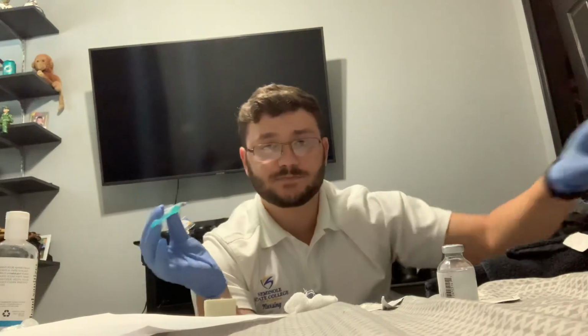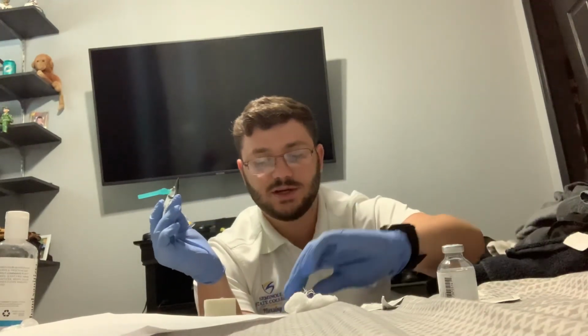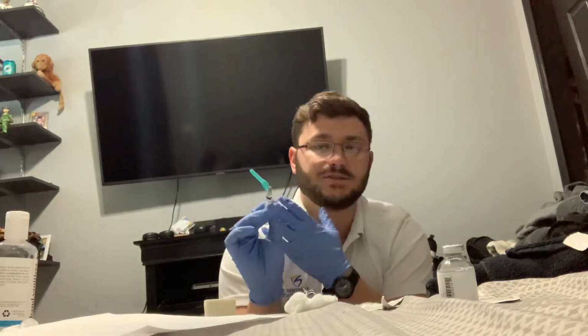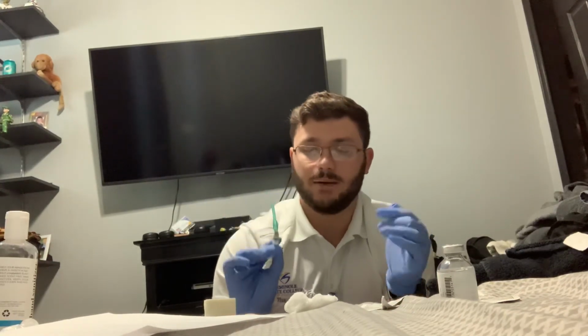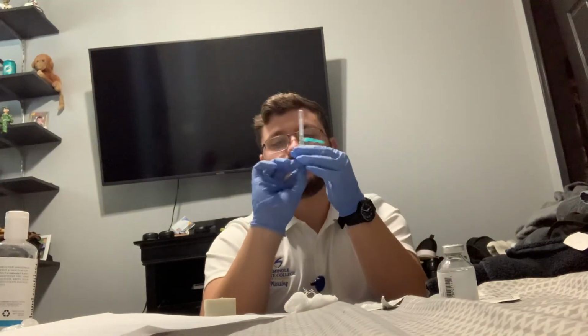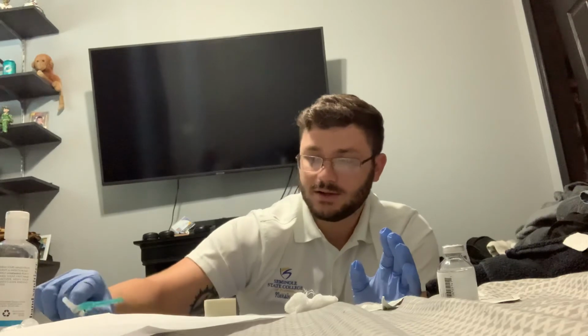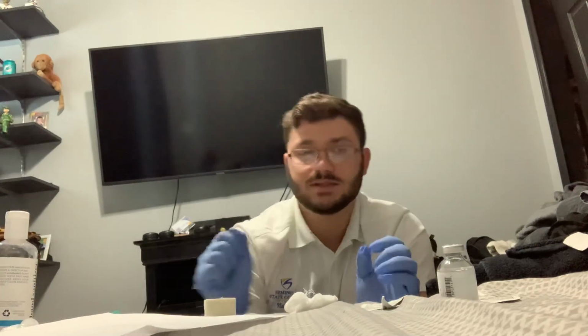In this case, I'm going to recap my syringe to dispose of it, because I do not want to engage my safety device as of yet, because we want to reuse these needles in nursing school, not in real life. It sounds so bad out of context. So I'm going to recap it, clamp it shut. Okay, and I would usually dispose of it in a sharps container. So this has been disposed.